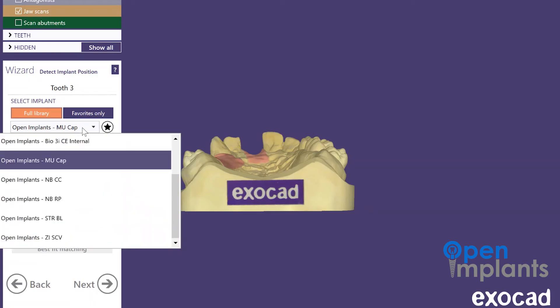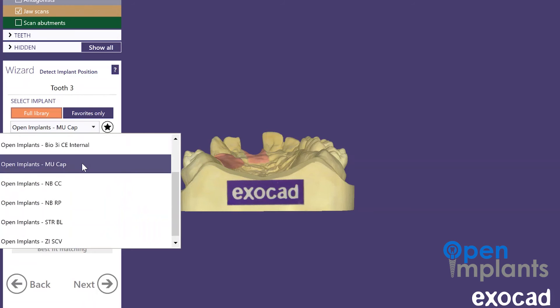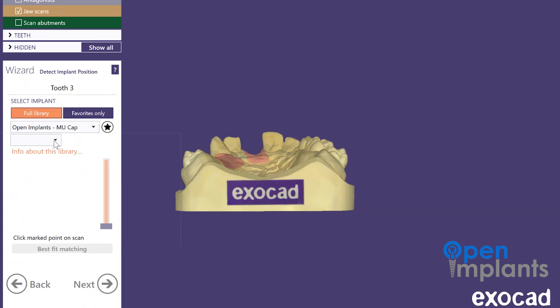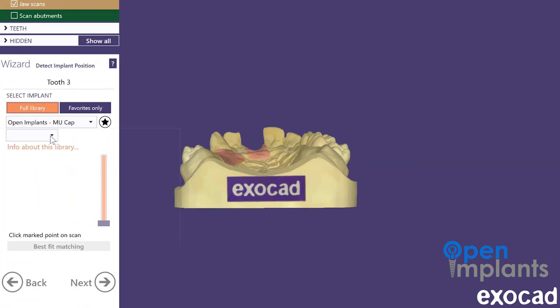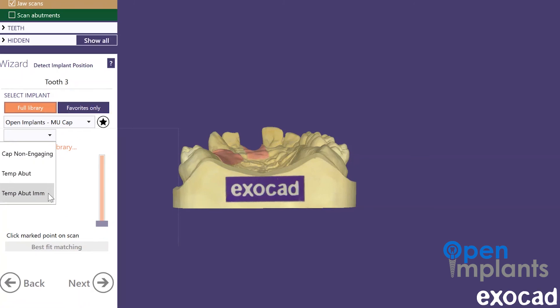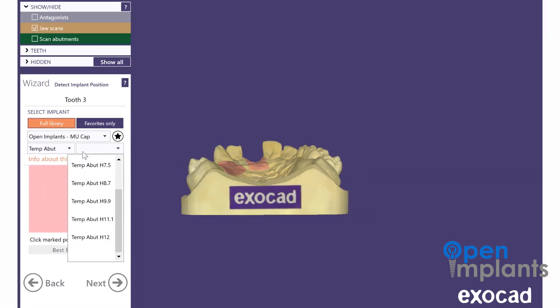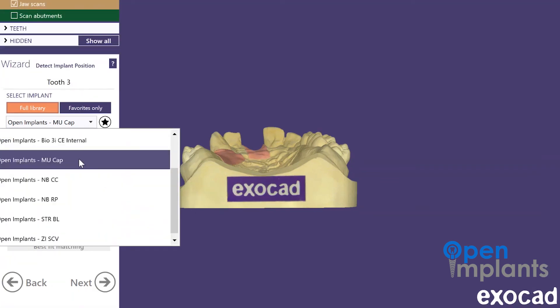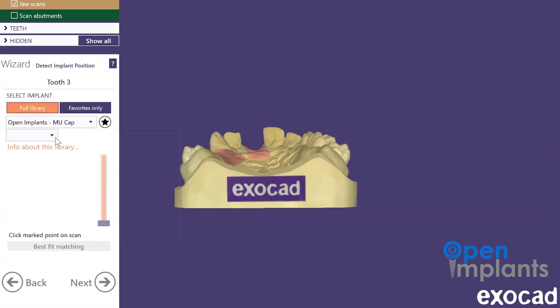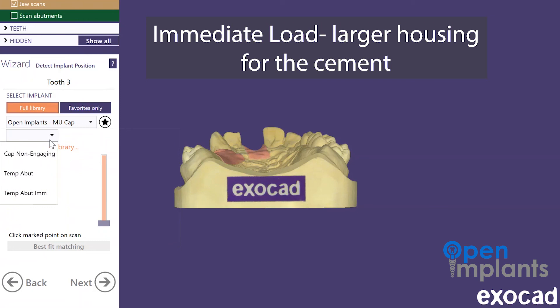The last thing I'd like to point out is the multi-unit selection. This option is for non-engaging implant caps, compatible with the Nobel multi-unit titanium inserts. Find the multi-unit temp non-engaging parts in the drop-down menu as well. Once the system is selected, you have options for the kit up to heights of 12mm. The option at the very bottom is for immediate loads, so it will give you more space between the titanium base and the final crown.